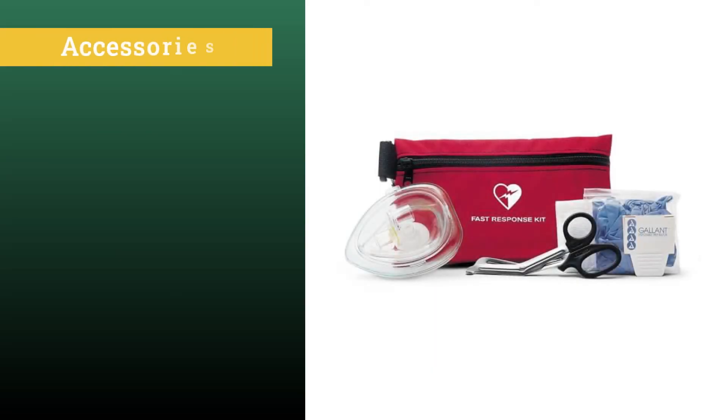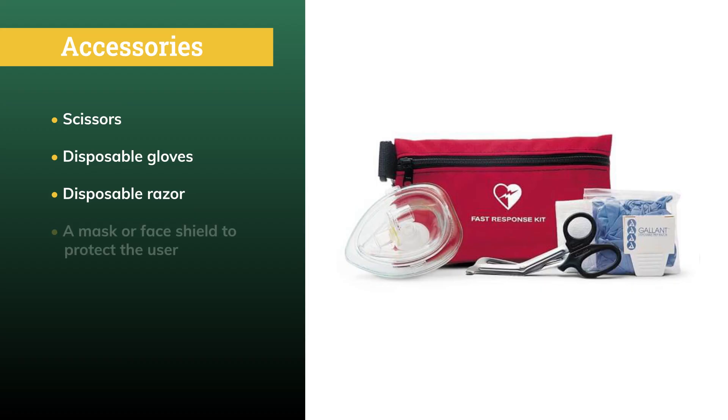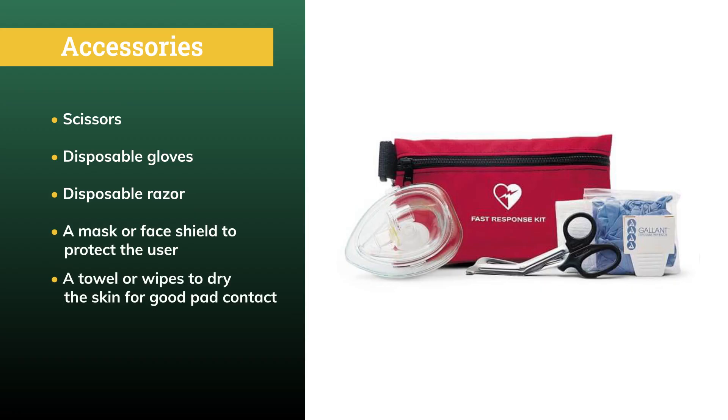Other suggested accessories include scissors for cutting through clothing, disposable gloves to protect the user, a disposable razor for removing chest hair if the pads cannot make good contact, a mask or face shield to protect the user, and a towel or wipes to dry the skin for good pad contact. These items are available separately in a Philips Fast Response Kit.